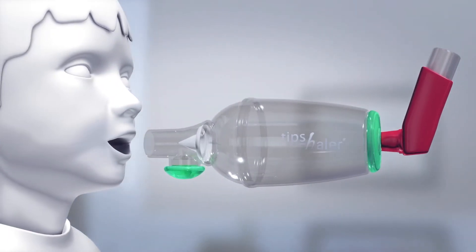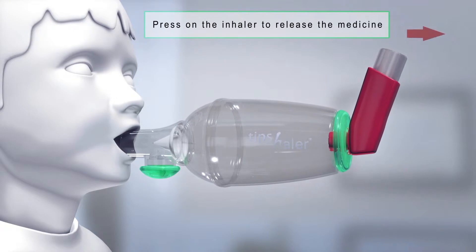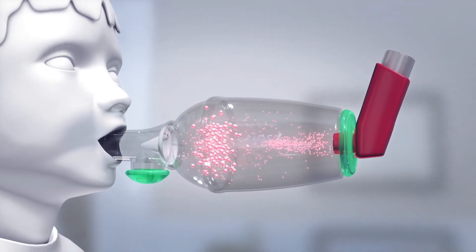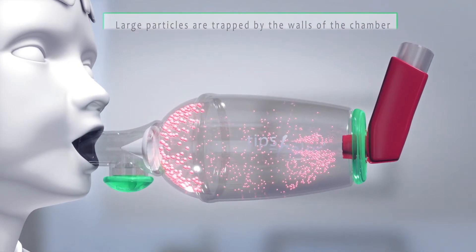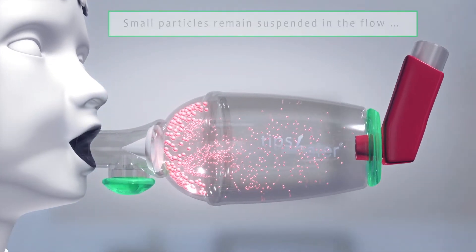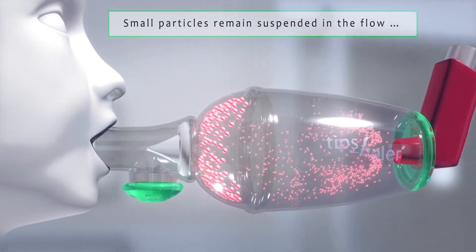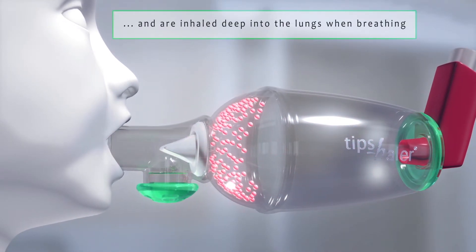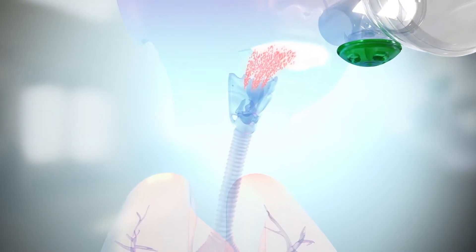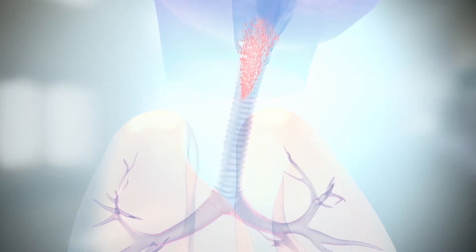The metered dose inhaler releases drug particles in the valve holding chamber in an aerosol form. Thanks to its material, Tipshaler walls quickly catch large particles, allowing the thinnest particles to remain suspended in the valve holding chamber. Small particles can thus deposit deep into the lung where their efficiency will be maximum.